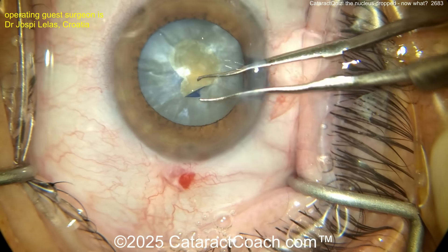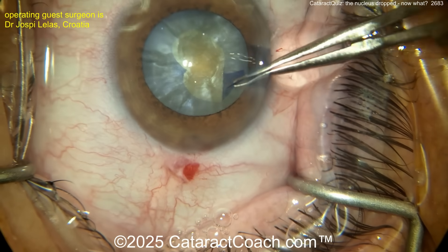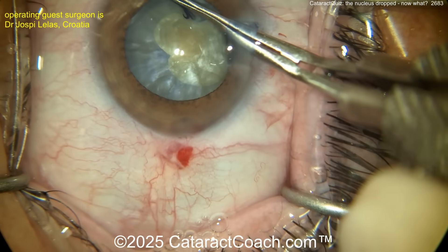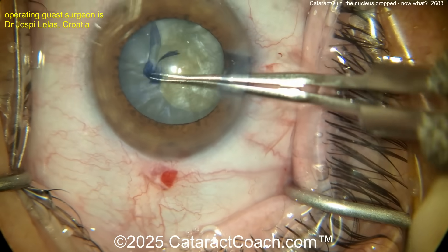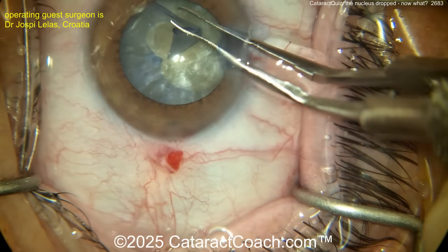Starting to make that second rhexis here — make it a little bit bigger. Careful, don't let that thing run out. Oh, it's getting close there. Bring it around, bring it around again. I may do the little maneuver here — it's going to run out otherwise. Oh, I think it's gone.